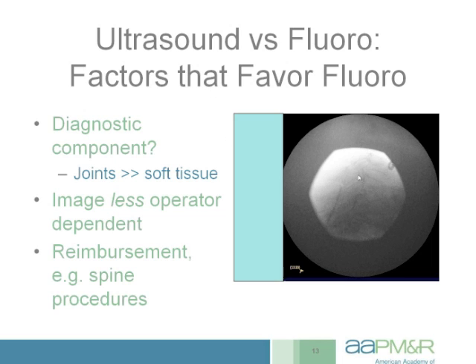In this picture I have here to the right, getting a good lateral image on a cervical epidural in a patient with a short neck and high shoulders, that does require some skill, and that usually requires some coordination between the physician and whoever is operating the fluoroscope. So it's not saying that there's no operator component with fluoroscopy, but it is a little bit more challenging with ultrasound, and it's going to require some practice and time.